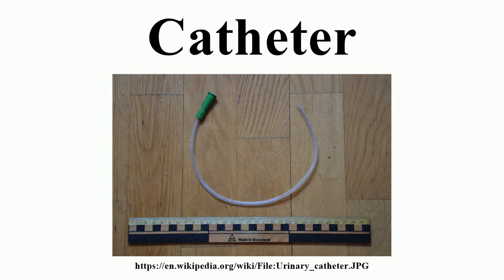An early modern application of the catheter was employed by Claude Bernard for the purpose of cardiac catheterization in 1844. The procedure involved entering a horse's ventricles via the jugular vein and carotid artery. This appears to be an early and modern application of the catheter because this catheter approach technique is still performed by neurosurgeons, cardiologists, and cardiothoracic surgeons.